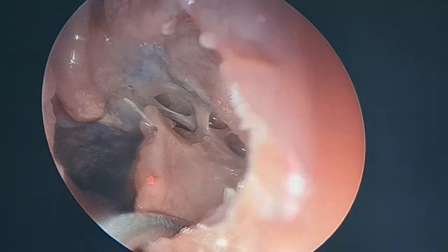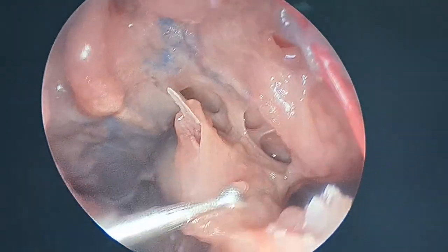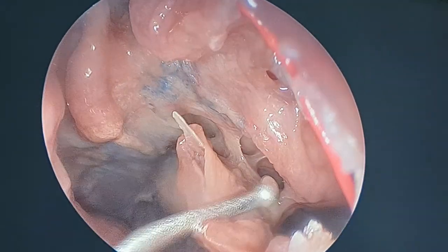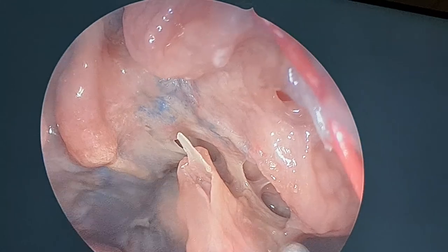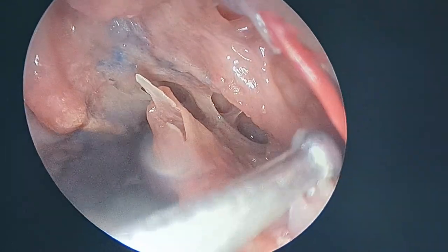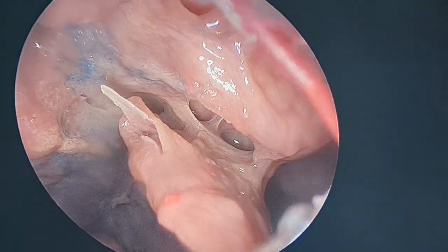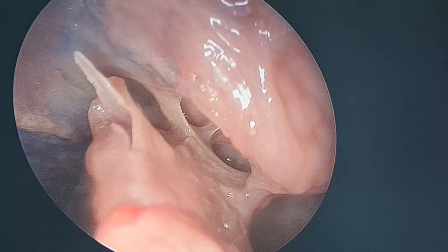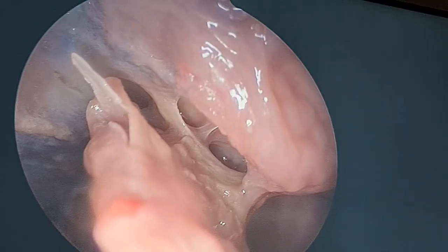See now, the moment I open this, what I have done, this was the uncinate. This was the hiatus. This three-dimensional space is the infundibulum. And see the infundibulum, what is opening in the infundibulum? You see laterally, inferolaterally, that is the maxillary sinus. See that? I will show with the angled scope.